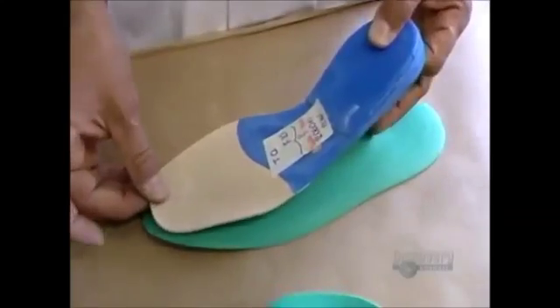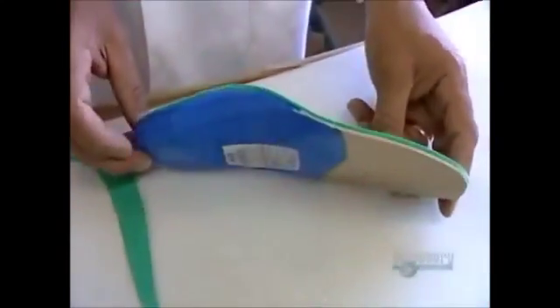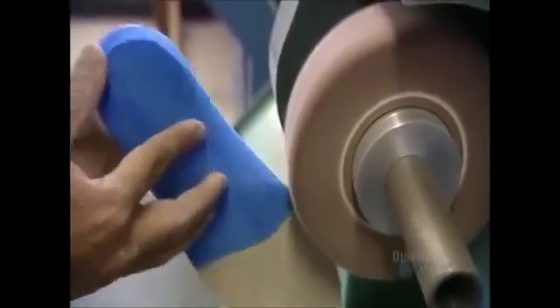They add made-to-measure corrective parts in latex foam. Then, using hypoallergenic glue, they line the orthosis with a soft polyurethane. All that's left to do now is buff the orthosis. This smooths all the surfaces.